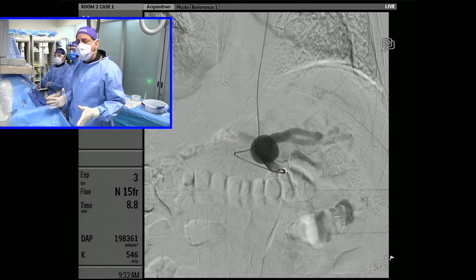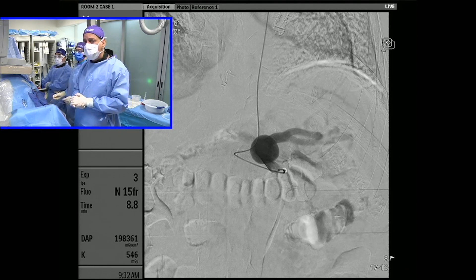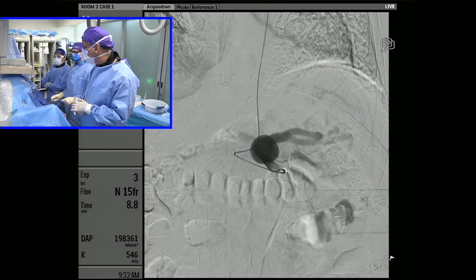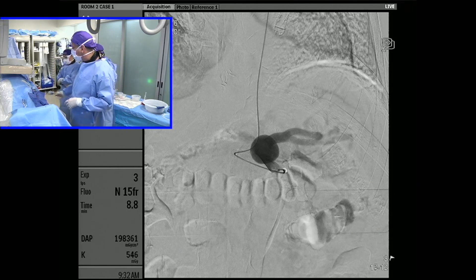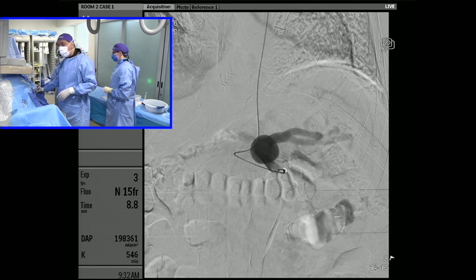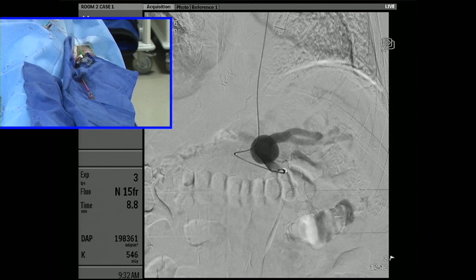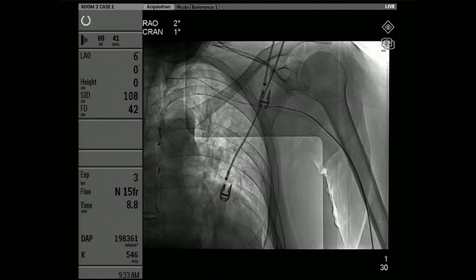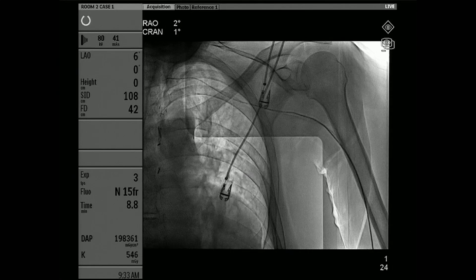As our standard protocol, we have a six French slender sheath in the patient's left wrist, which you can zoom in here to see. We actually have a seroradial catheter — a 110-centimeter seroradial catheter.